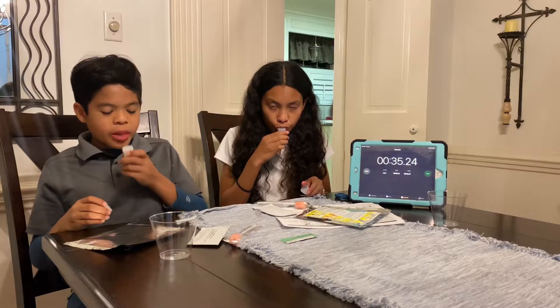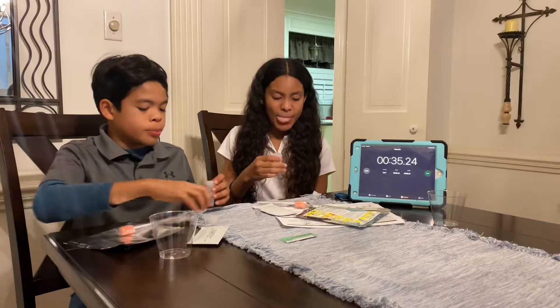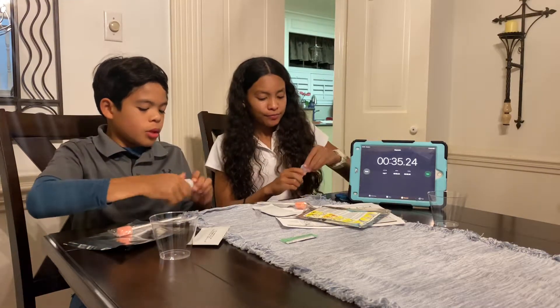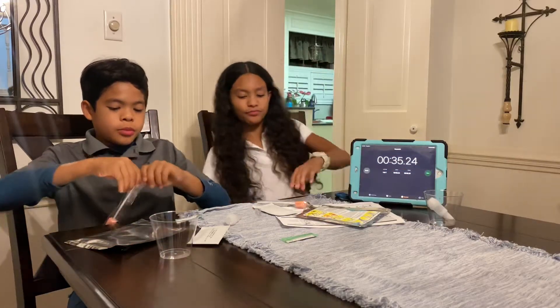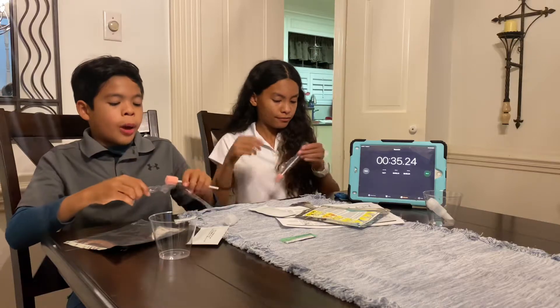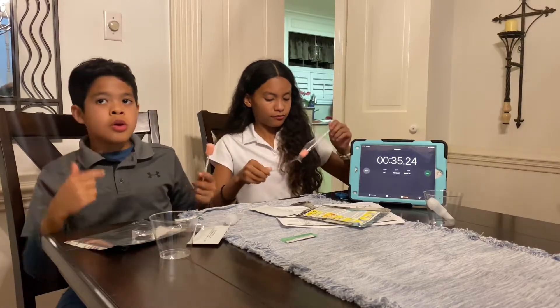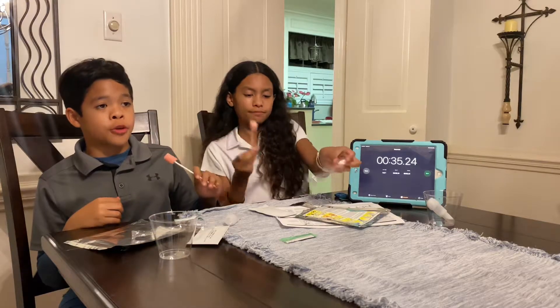Next, you'll take the cotton swab. You'll open it and stick it in your mouth, rubbing it on your gums, around your cheeks, and under your tongue for 30 seconds.